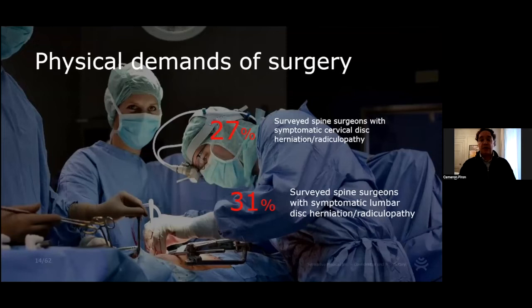A lot of other surgeons actually don't use a microscope. It takes too much time. So they use something called loupes, or they just look with a headlamp and a pair of glasses, and it forces them into very contorted positions during surgery. It's actually quite astounding, as you look at the damage to surgeons, that they put themselves into these complex positions during surgery. About a third of them have cervical or spine surgery themselves. So you have spine surgeons doing spine surgery, and due to the surgery itself, they have to have surgery done on themselves. It's quite circular and very challenging for surgeons. The incidence is about 35 times higher than in the standard population.